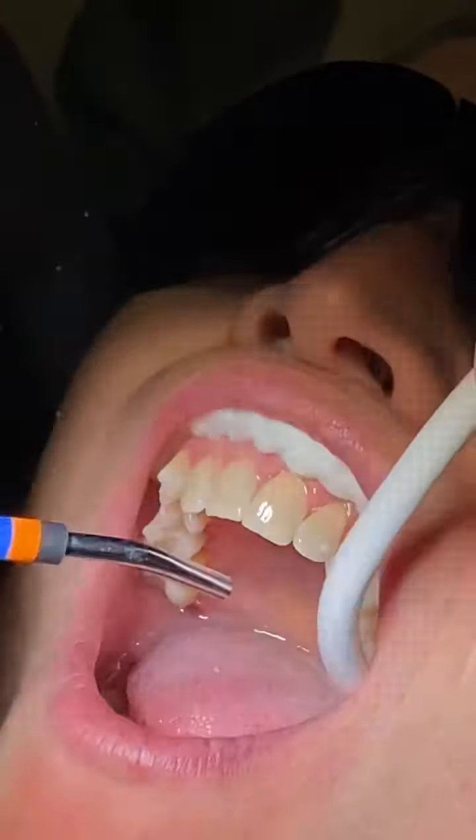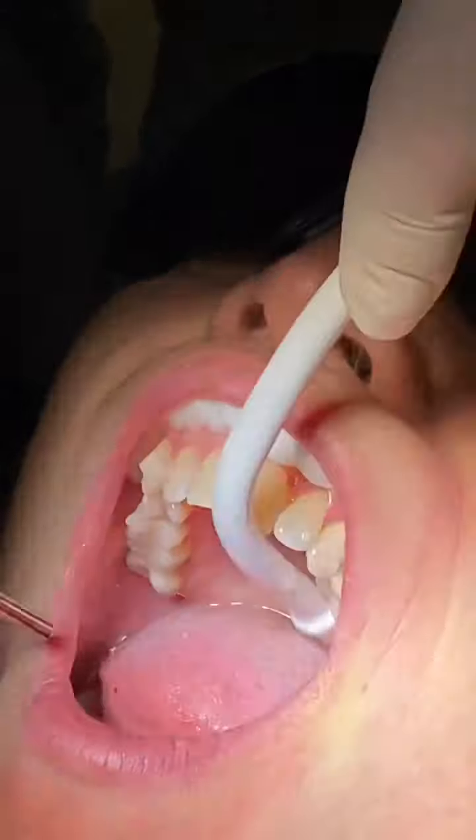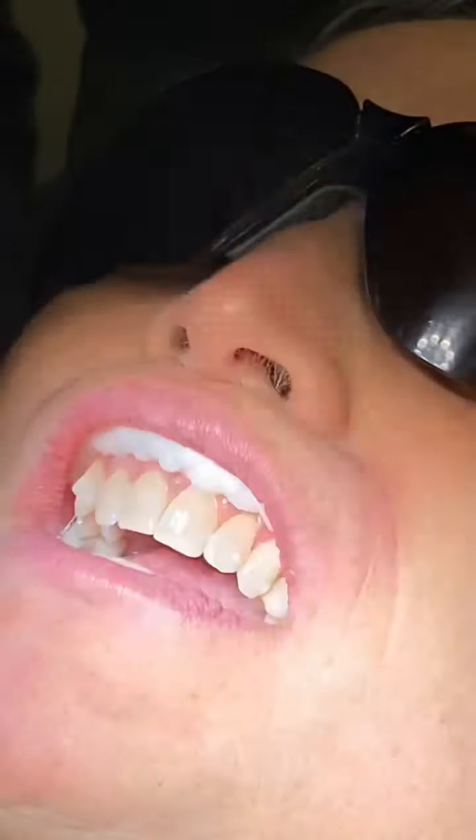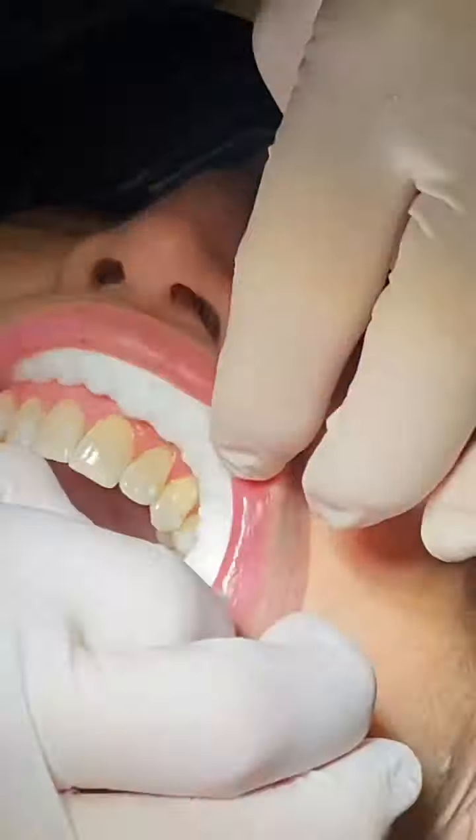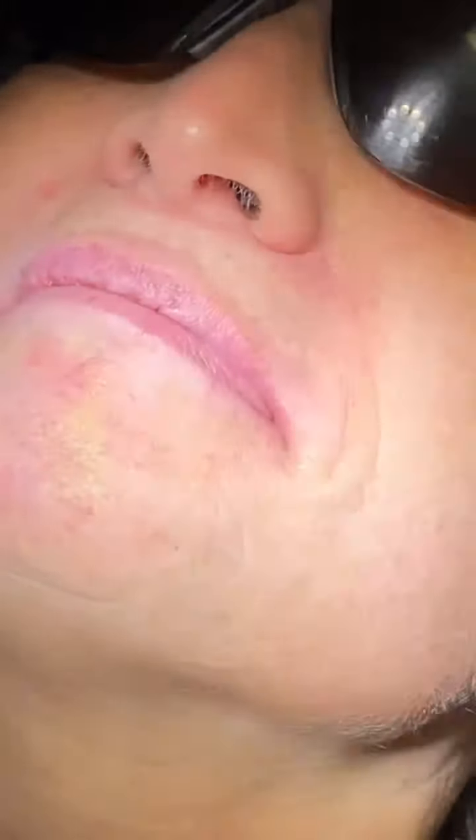This is the completed technique — very quick, very efficient. We're very happy we switched over to the enamel flowable. It made our life easier and the patients' life easier, and patients have remarked to us that they find it smoother. I'm Dr. Lenny Slachik, my office is in Montreal. I hope this helps you in placing your attachments — I think it's the material that should be used, and the results are beautiful and very efficient. Thank you.